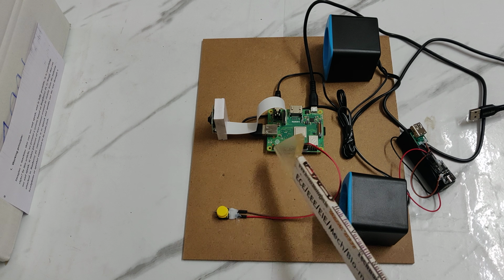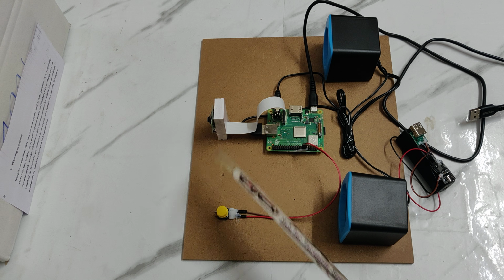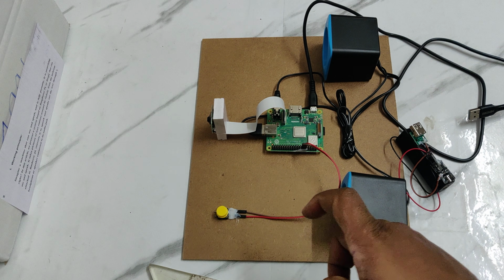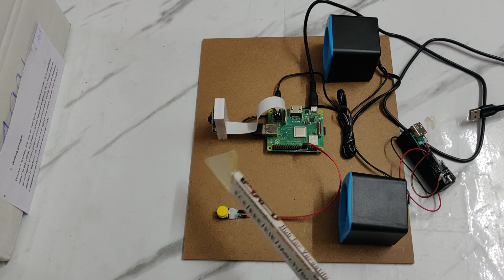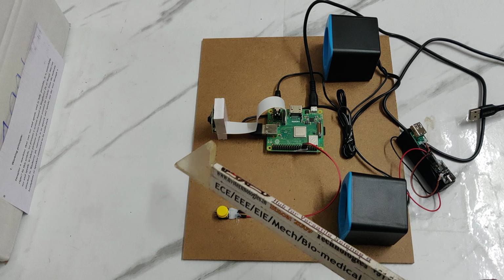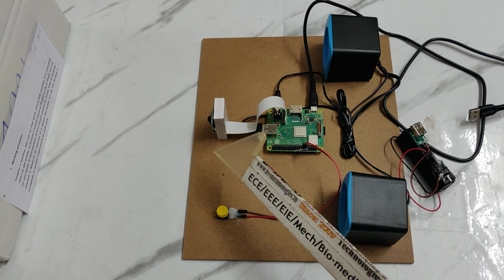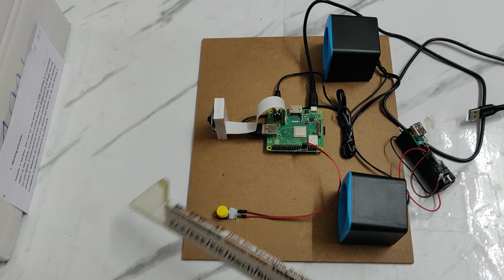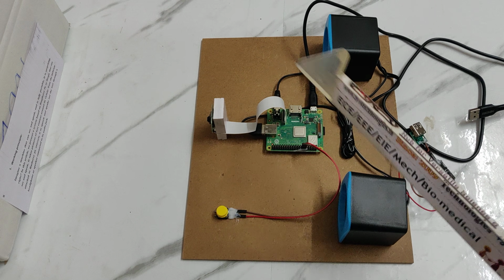That will be done with the help of the Raspberry Pi 3 we are using here, and for image capturing, a Pi camera. Whenever he or she presses and releases the switch, the system will capture the image. The next stage is converting that to grayscale, and then to OCR. It's the Tesseract OCR package we are using to extract the text from that grayscale image, and then the eSpeak module to read out the extracted text. To capture the image and convert it to grayscale, we are using OpenCV. In total, three major packages are used in our project.